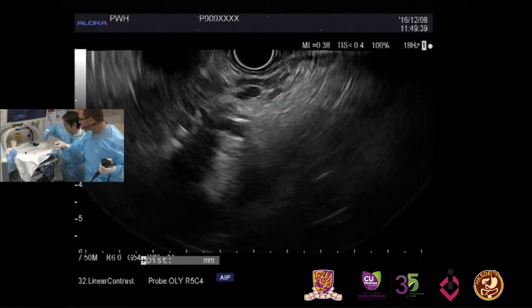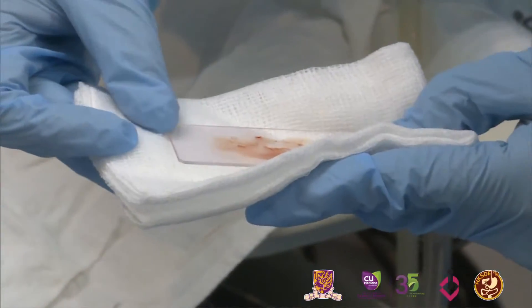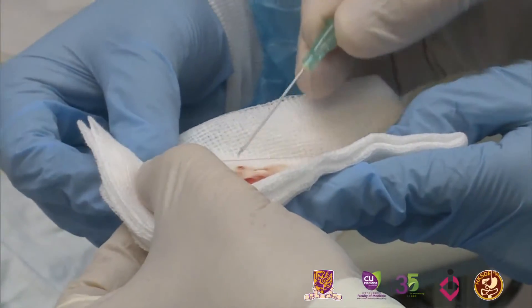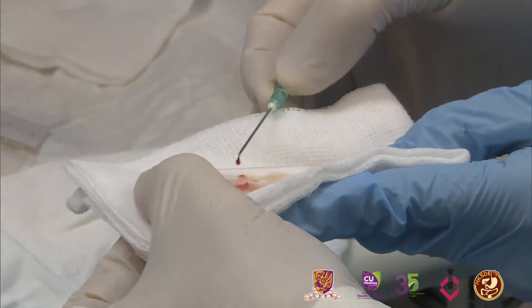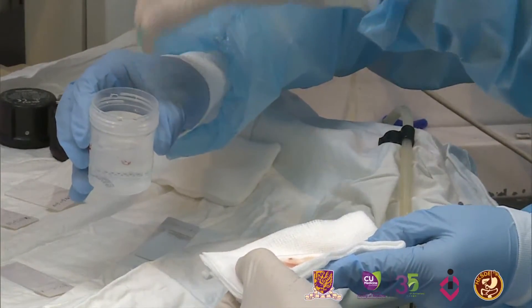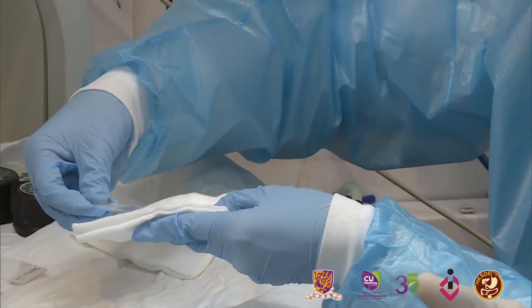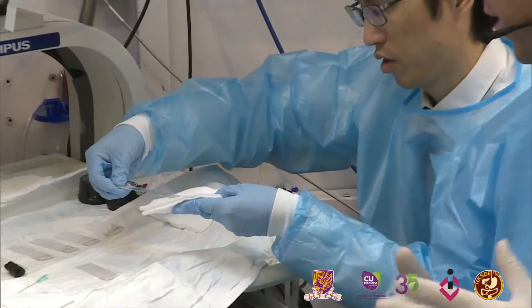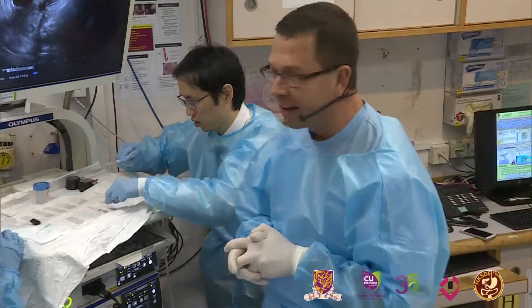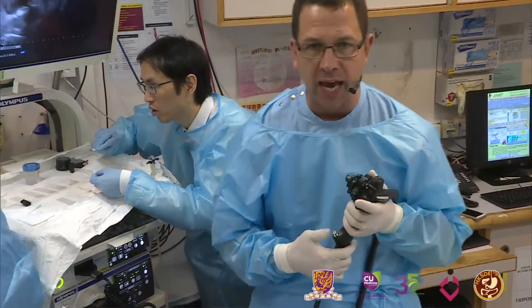We've gotten a nice core of tissue — quite impressive. We're going to pick up this core of tissue and place it in formalin for histology. We'll smear the remainder to get a cytological sample. If we had on-site cytology, we could do an immediate Diff-Quik stain to assess adequacy. Since we don't have on-site cytology, I'll do four to five passes to be sure. We've just finished our fourth pass and each time got a good amount of tissue, so I'm reasonably confident we'll have an adequate specimen.